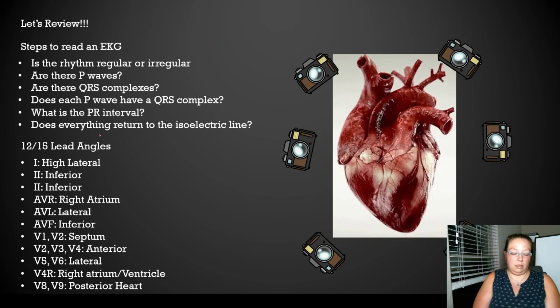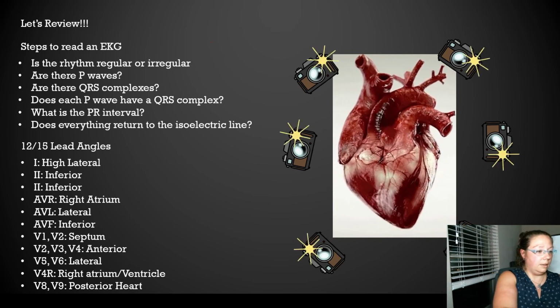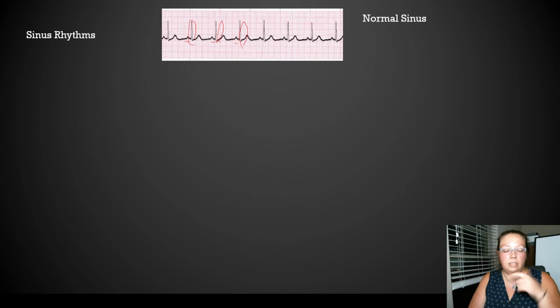I want to make sure I am consistent with this. Sometimes when you do it enough, it just clicks. So normal sinus, this is what it looks like. Regular P waves, QRSs, and a short PR interval.